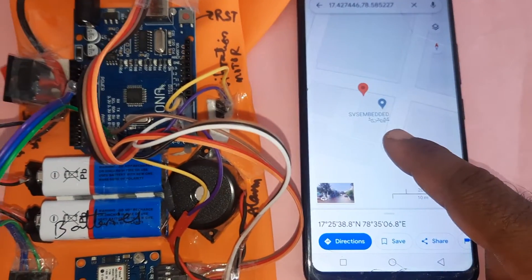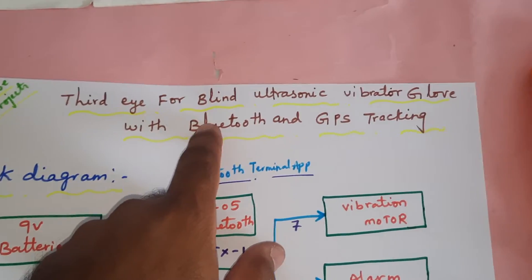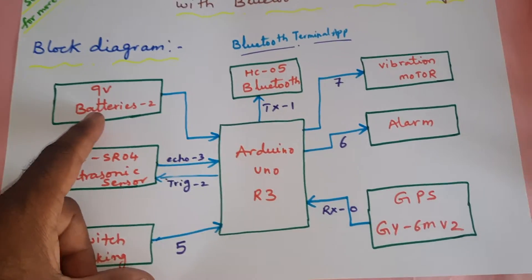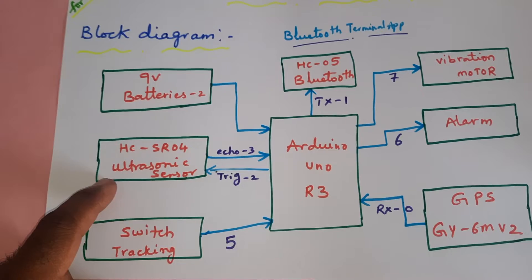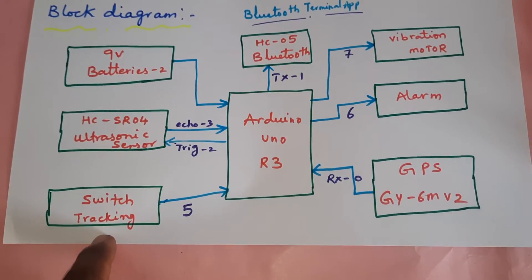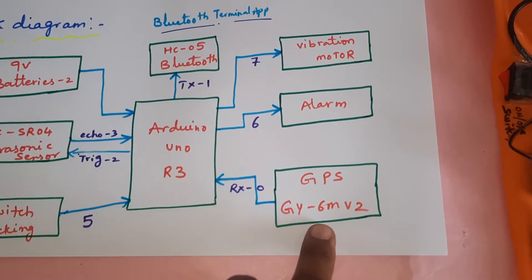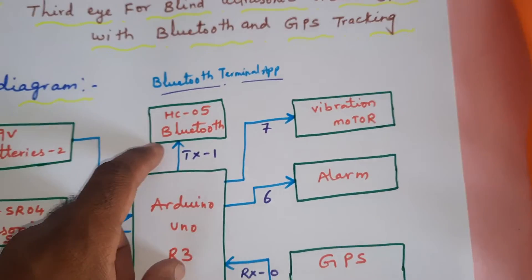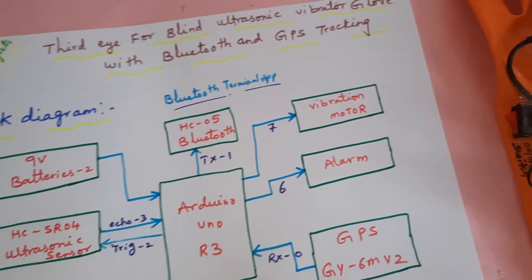So, third eye for the blind using ultrasonic vibration glove with Bluetooth and GPS module. Components include two 9-volt batteries, Arduino Uno R3 board, HC-SR04 ultrasonic distance measurement module to detect obstacles, one tracking switch button, GPS GY-6M V2 module, alarm, vibration motor, HC-05 Bluetooth module, and we are using the Bluetooth Terminal app.